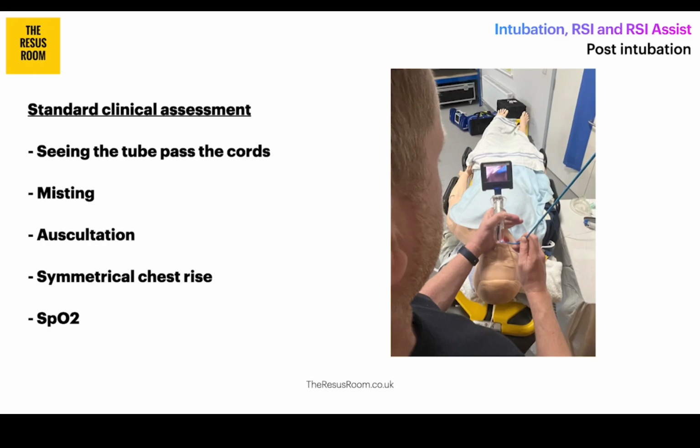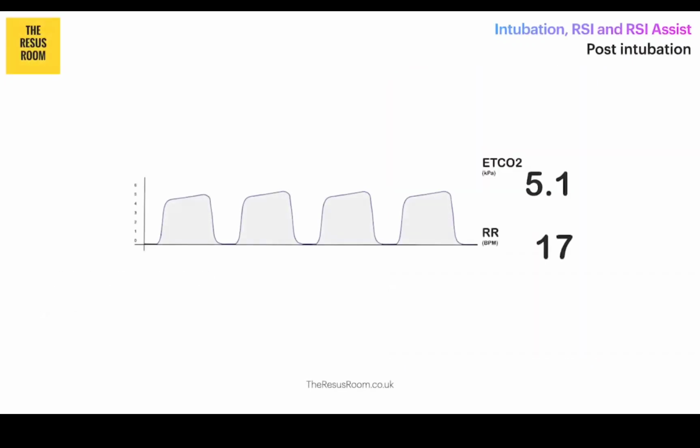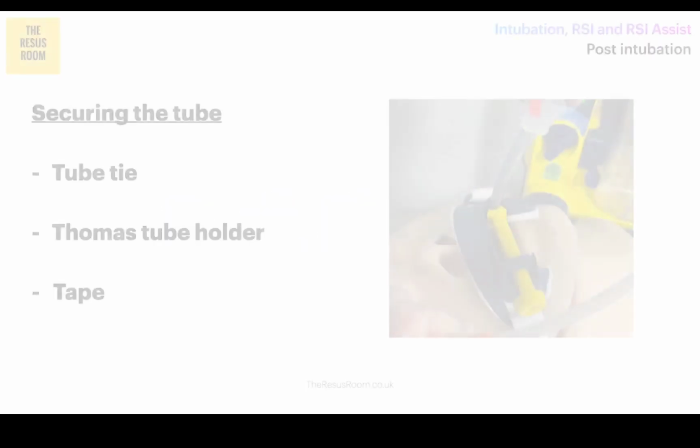So lots of elements in a standard clinical assessment, and I still do all of these. But the most important step in confirming correct placement of that tube is reliable and consistent waveform capnography readings. Without it, you are not in the right place.